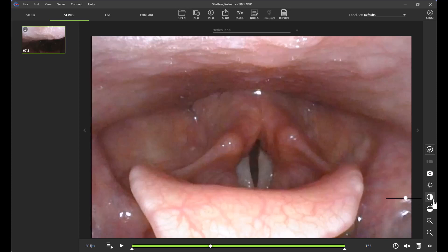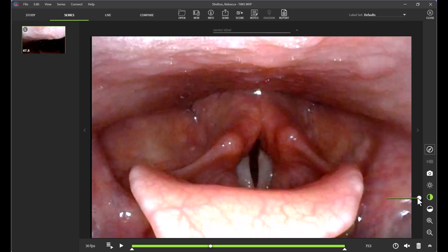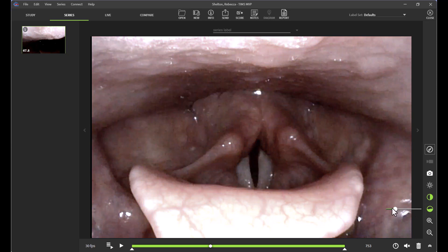I can also adjust my contrast and my saturation with the two icons below the sun. So again, dragging to the right is going to increase that contrast and saturation, and then dragging to the left would decrease it.